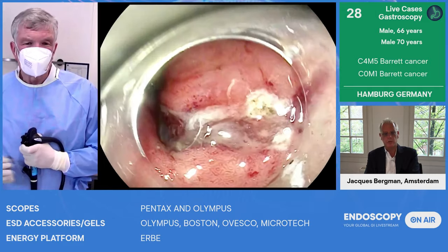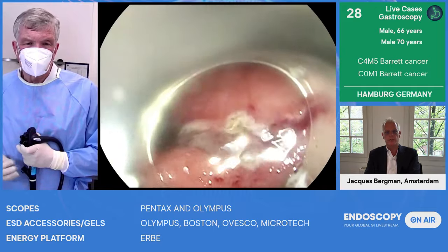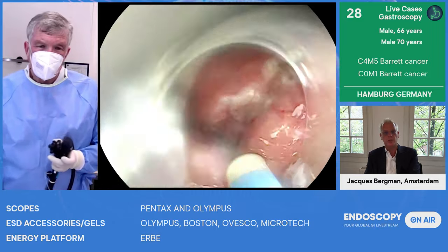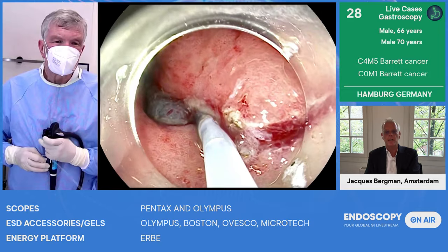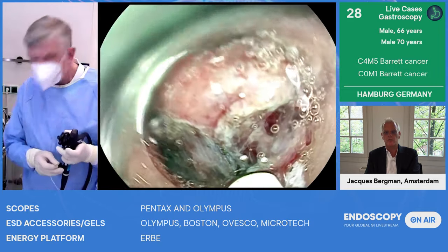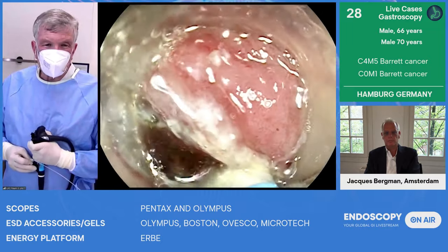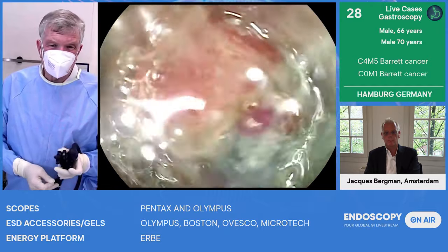But lesions like this are pretty strenuous on your endoscopes when it comes to the angle the endoscope can make. And not all endoscopes really give you optimal retroversion, even within your department, endoscopes of the same type. So this is something you need to check before you start your procedure. Do I have one of my best retroflexing gastroscopes for a case like this? Absolutely, that's a big problem. And there is some wear and tear with endoscopes.